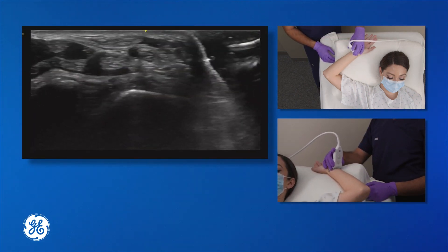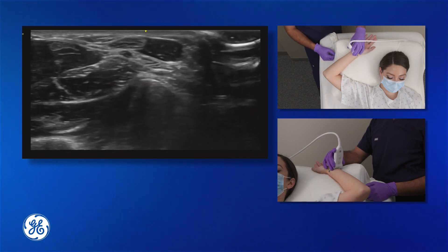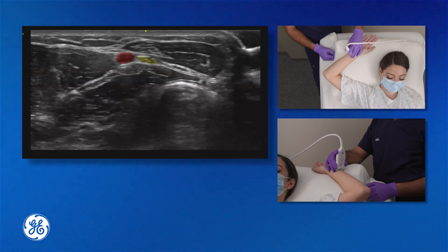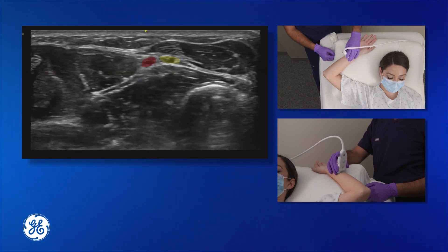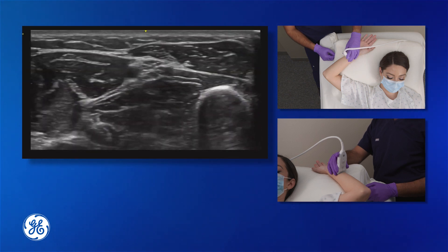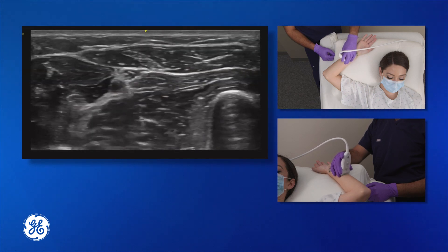The ulnar nerve cannot be seen at this location. We'll slide the probe proximally and the ulnar nerve will show up next to the ulnar artery. You can see that just by sliding a little bit, the ulnar nerve is already adjacent to the ulnar artery, but this is not a safe location to perform the block.